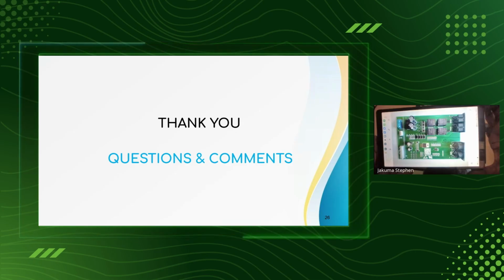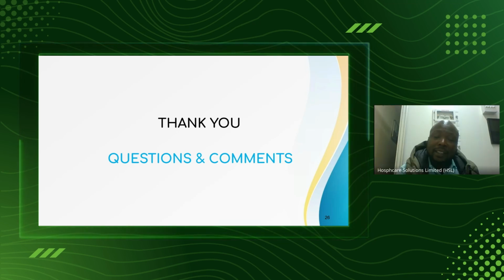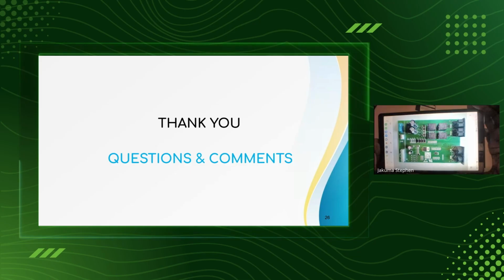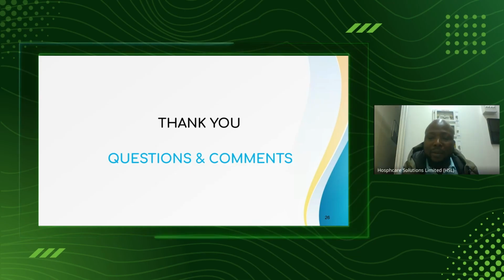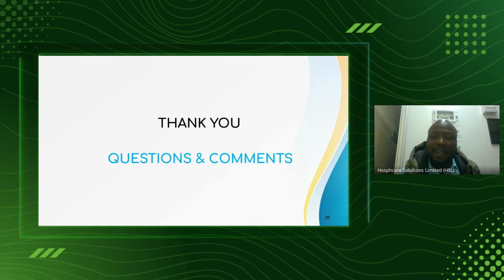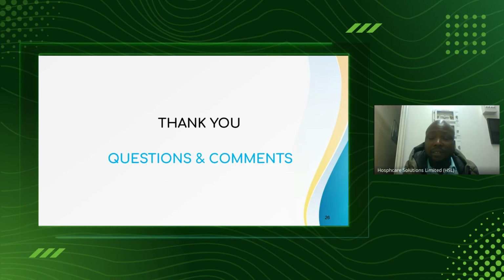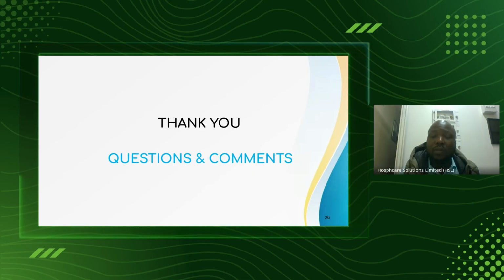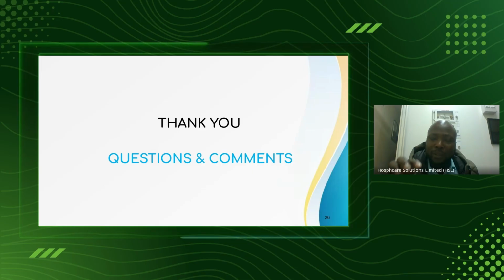So if you change the one directly linked with the backrest, the board will behave. If you have another board, try another board and see if the problem goes. So the board can be okay, but the relay is faulty. Yes. Okay, so I can think of getting some relays. Yes, or even just find another board to be sure the machine is okay.